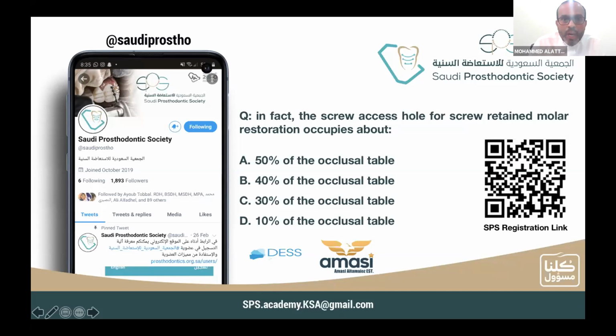Why do we place four implants in the maxilla for overdentures? You can place two implants for the overdenture, but your final prosthesis will be full coverage. We place four implants for the maxillary overdenture to make a U-shaped or horseshoe-shaped, roofless prosthesis. If you place only two implants in the maxilla, you will not make a roofless prosthesis. You should cover all areas.